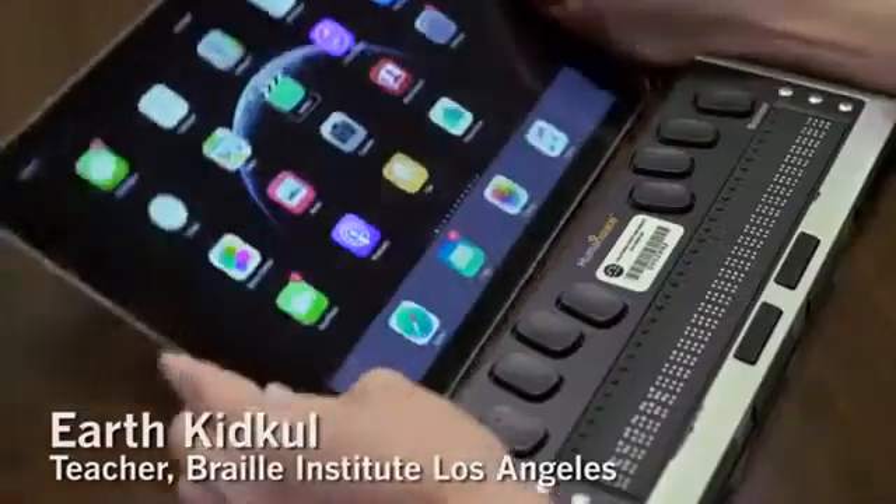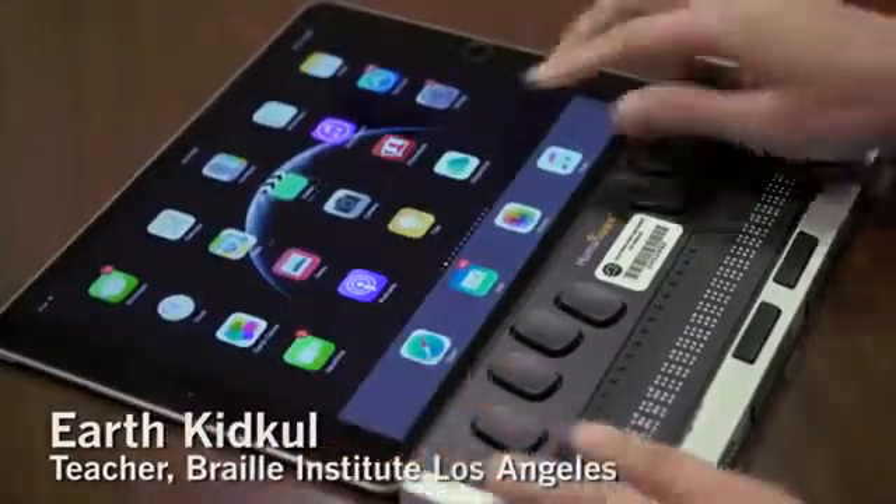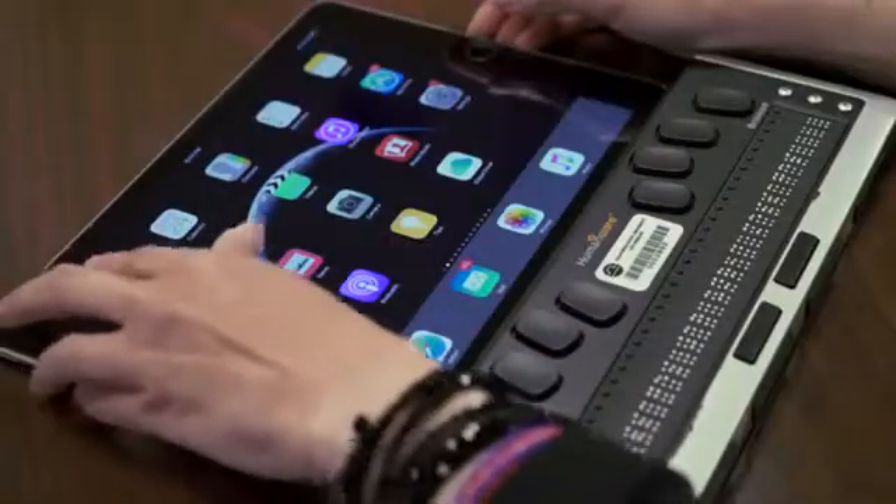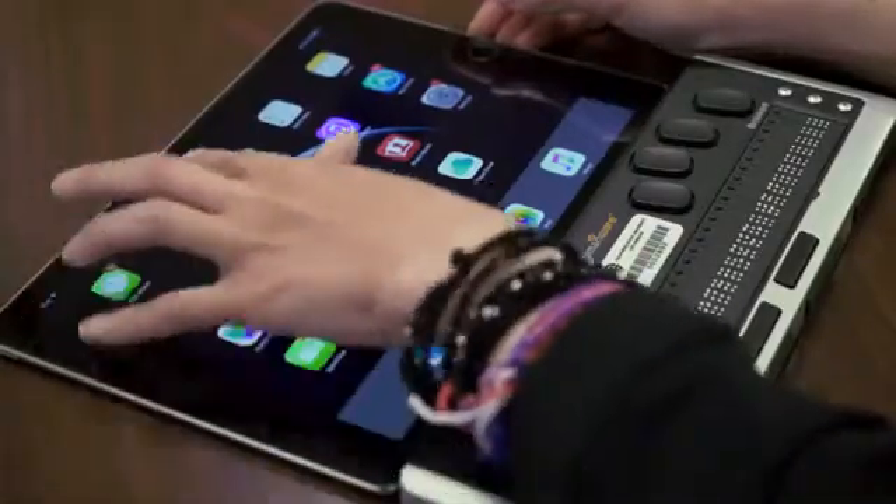This is the iPad Air. It has a voice program built in that you can navigate, and this is pre-installed. Anything you touch on the screen, it will tell you what you're touching.